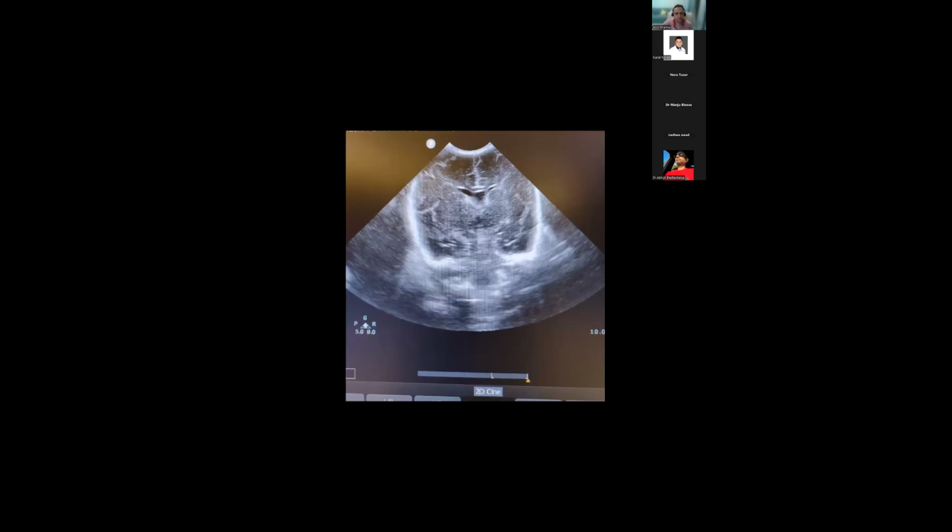Okay, this is a 28 weeks preterm baby, 1.1 kg. When I did this image, he was two weeks old and on non-invasive respiratory support at that time. The quality is not good, maybe because I took a freeze and after that took a photo from my mobile. So it's perfect. There's nothing wrong with it. For interpretation's sake, it's absolutely fine.